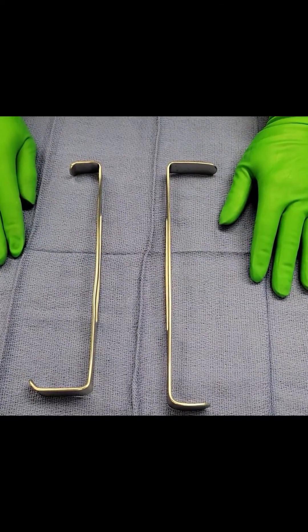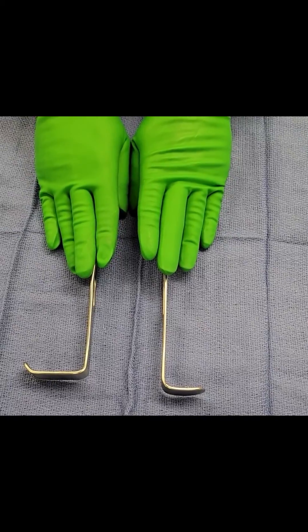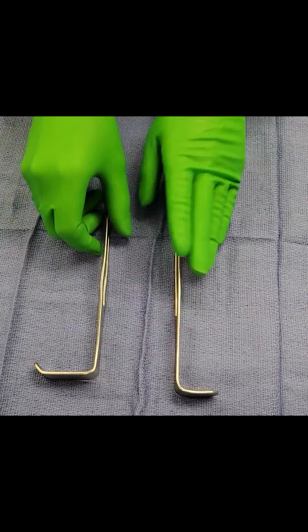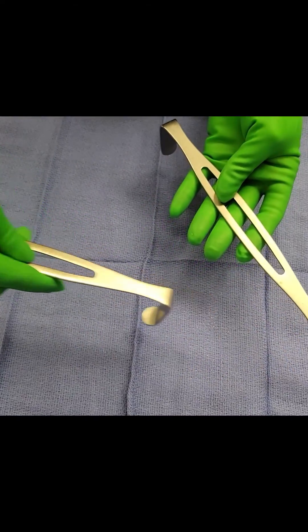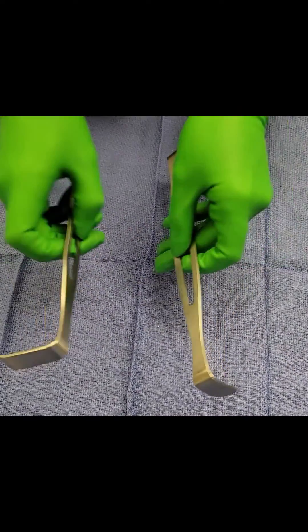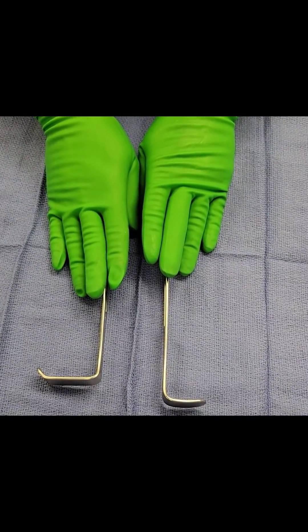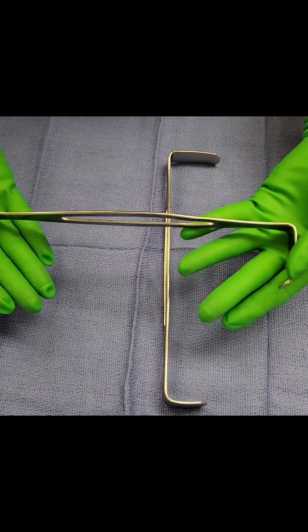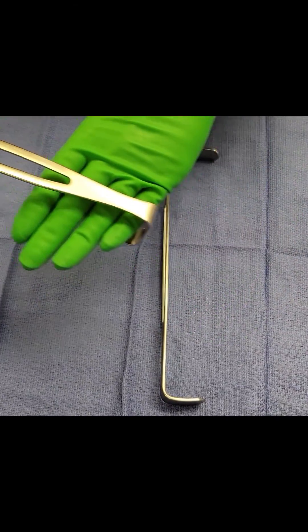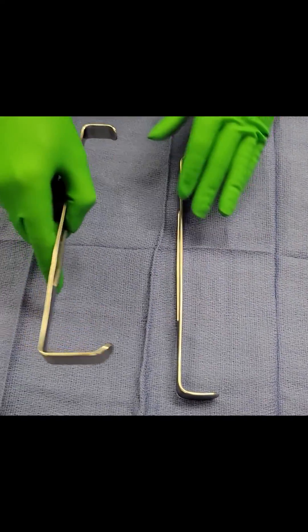The first thing I want to touch on is a hand retractor versus a self-retaining retractor. The Army-Navy is an example of a handheld retractor. Handheld retractors do what our hands or fingers could potentially do during cases, except we get to do them with an instrument — it moves things out of the way where our finger or hand could move it out of the way.